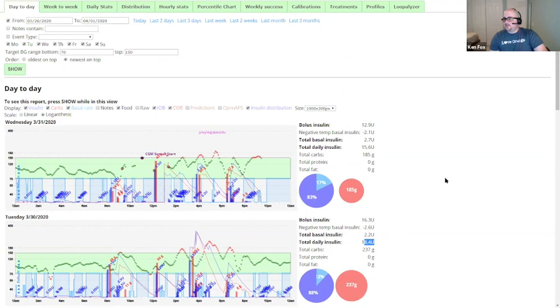So yeah, there we go. The Nightscout reporter link that Odd listed, yeah, is fine. I don't know. It's fine.